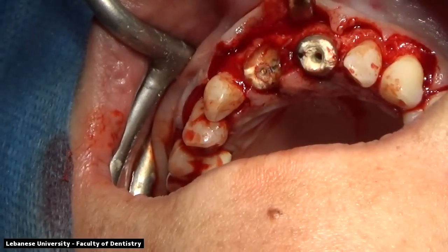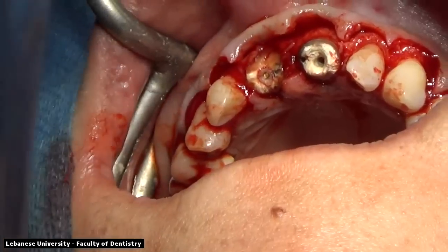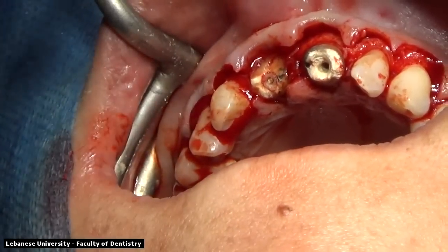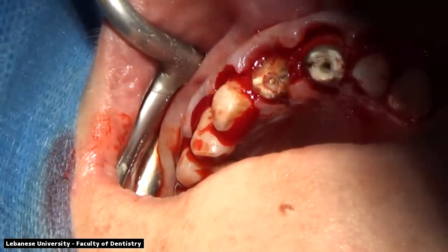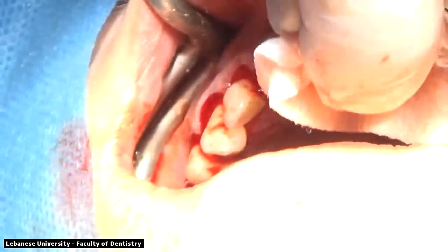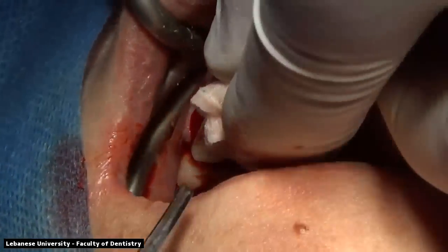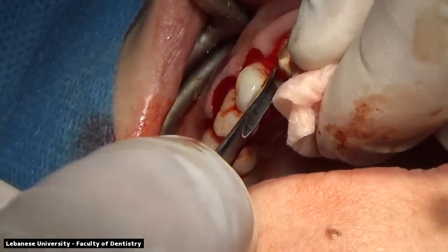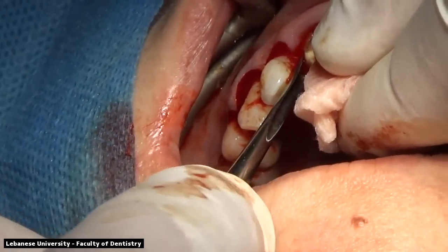Root canal treated teeth usually fracture a lot during extraction, and they are very fragile and friable, so it's very important to atraumatically remove them as much as possible. If they do break, you have to open a wider flap and try to go in with burrs or with the remaining root elevators so that we can remove them without tension.